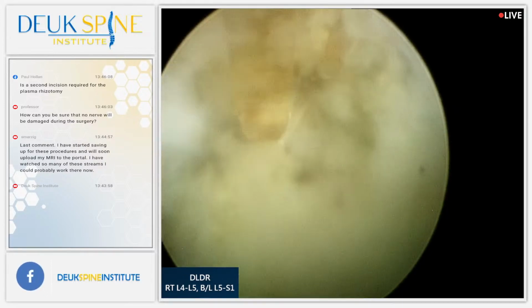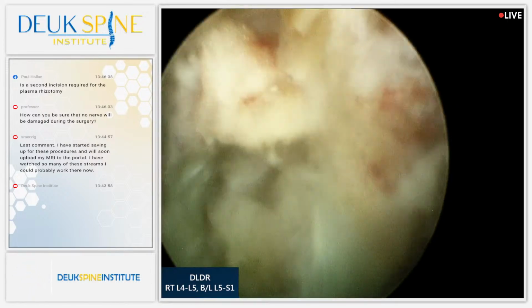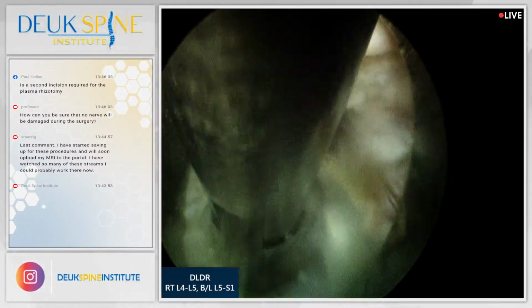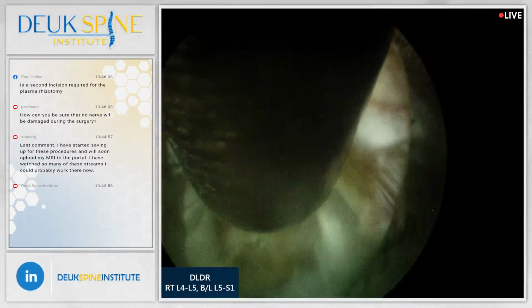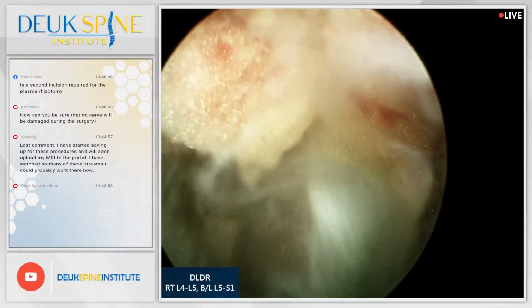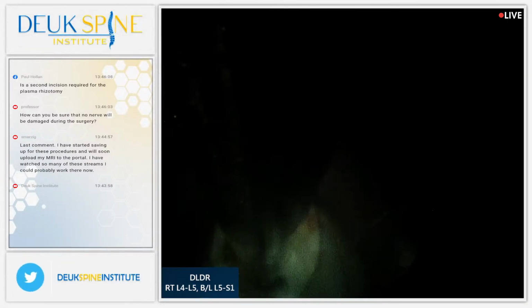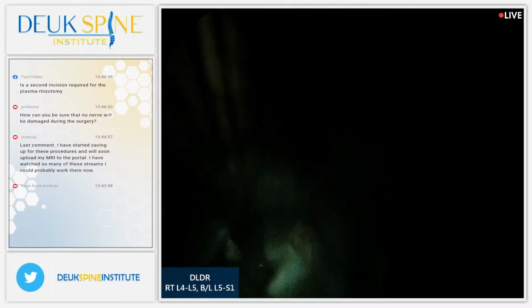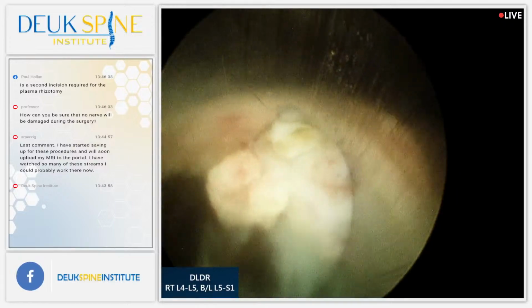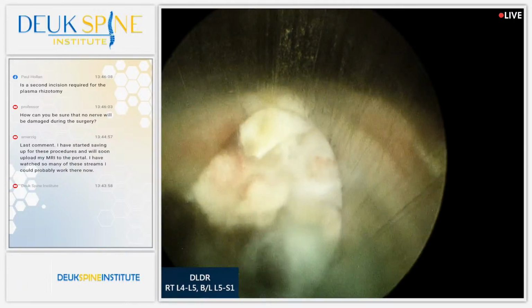We just have 2 questions. Next one coming from Professor, once more on YouTube, asking, how can you be sure that no nerve will be damaged during the surgery? Well, first of all, I know where all the nerves are. And so, as a neurosurgeon, it's my job through my training to not damage nerves. So I can tell you, we don't damage the nerves. At least I don't. I can't say that for other neurosurgeons.